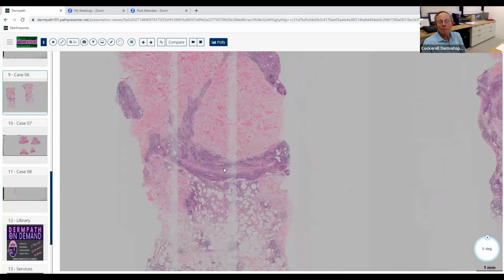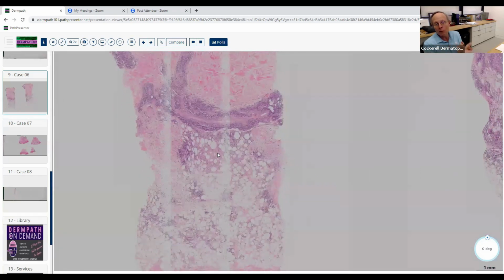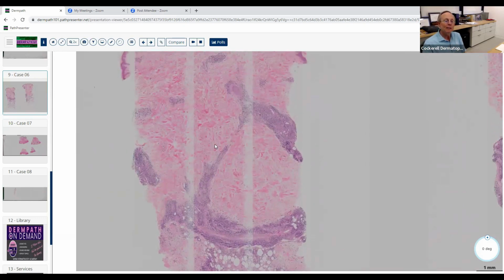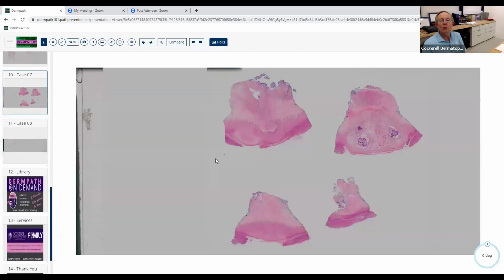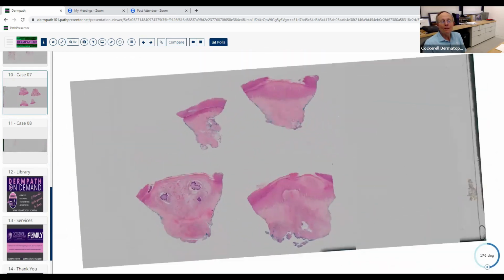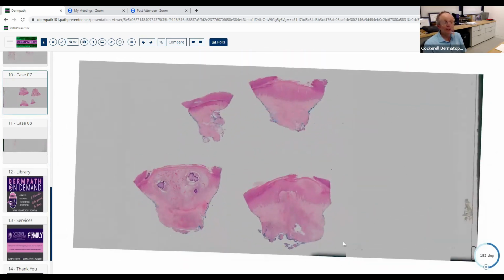And this is one that you definitely are going to encounter on the boards: lupus. So you may as well know everything there is to know about it. You're probably going to encounter a biopsy of lupus on the boards. They might show you a DLE with interface change, follicular plugging, et cetera. Some things probably aren't going to come up, some esoteric tumor, but you are going to get this. So you may as well just go ahead and be prepared for it.